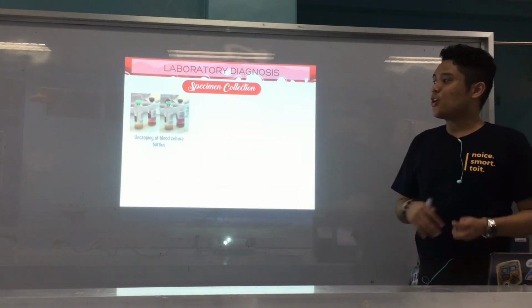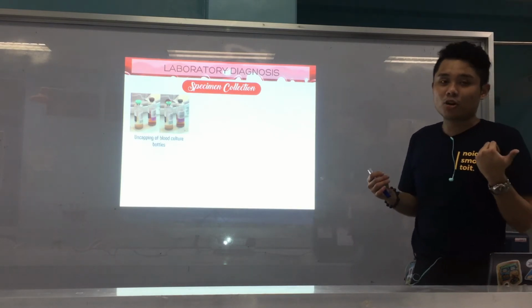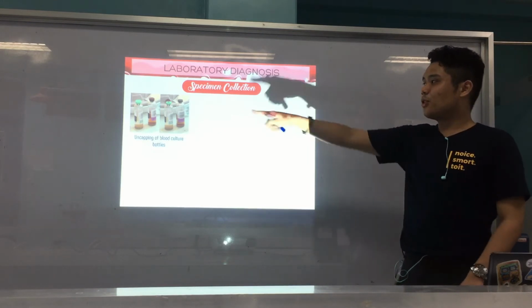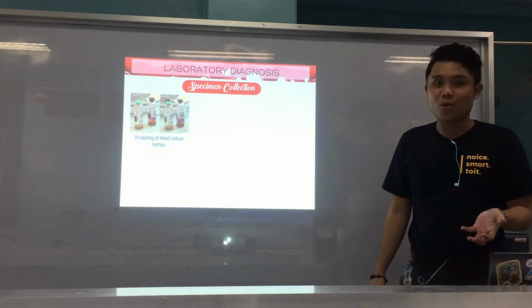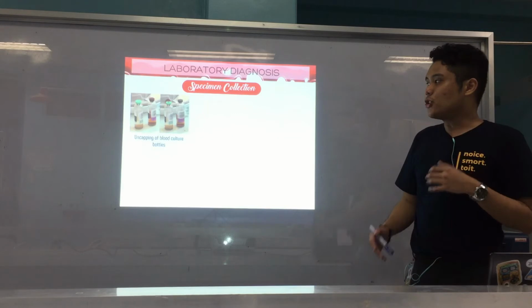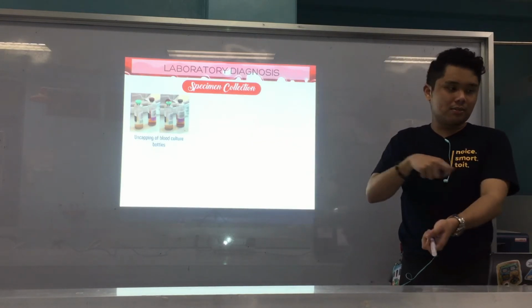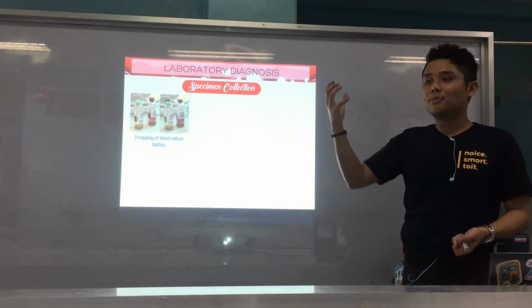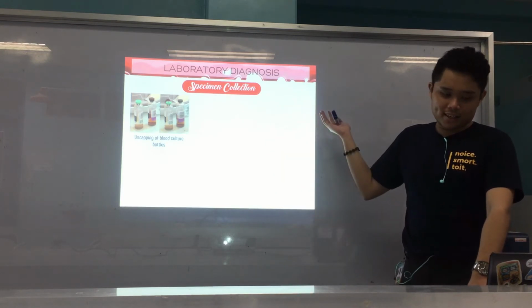Okay, so here's an example. Ayan, those are example of blood culture bottles. We'll discuss that later sa different systems or methods on blood culture. Okay? So, those are blood culture bottles. And inside them, they have already the broth. Okay? Kanang broth na brown dira. That's already an enrichment broth for the blood. So, what you do is, kaning test tube bottles, after nimo og syringe, no, venipuncture, imong i-inject ang syringe dito and then imong i-dispense ang blood. Okay, so we'll see in this procedure.